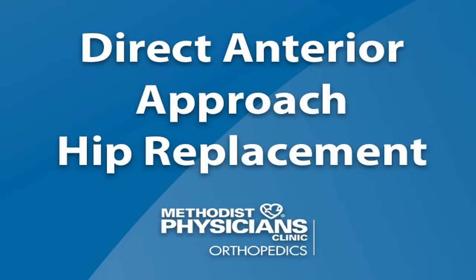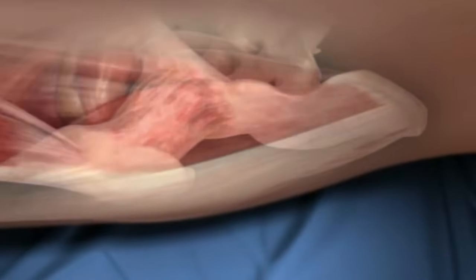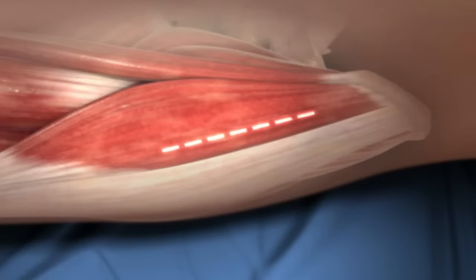This video that you're about to watch is an animation of a hip replacement being done through the direct anterior surgical approach. What you're seeing now is the dashed line where the skin incision would be made. Typically the incision is 4 or 5 inches in length.